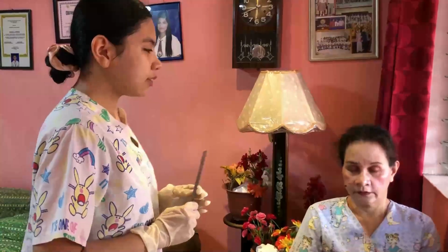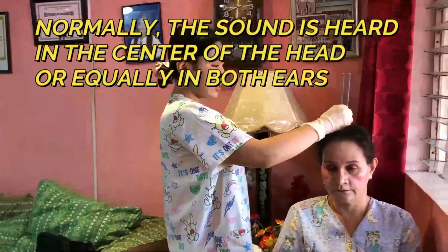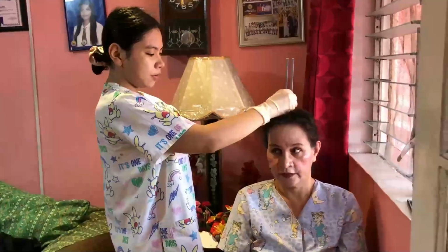Now I will be performing the Weber's test. Ma'am, I will be putting this tuning fork onto the center of your head and just describe to me what the sound is, okay? Do you hear the sound? Vibrating sound. Do you hear it equally? Yes. Okay.